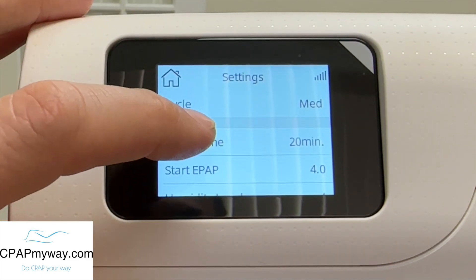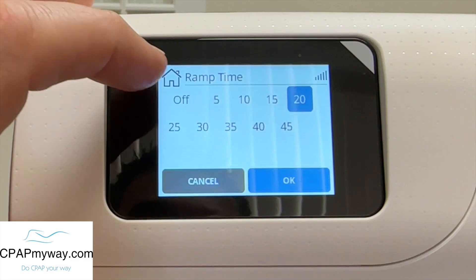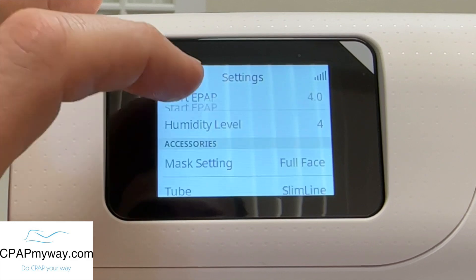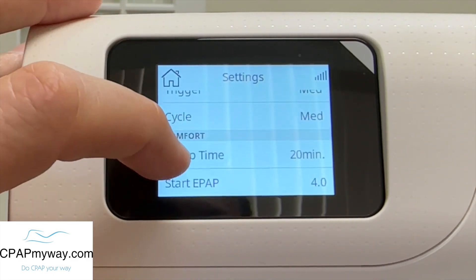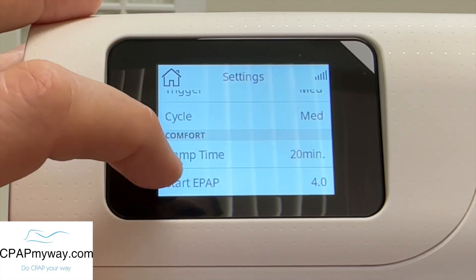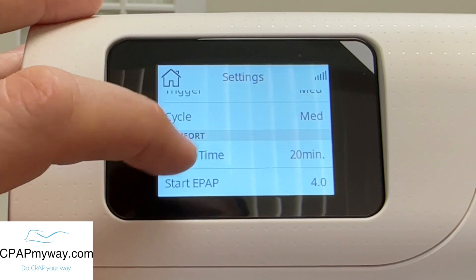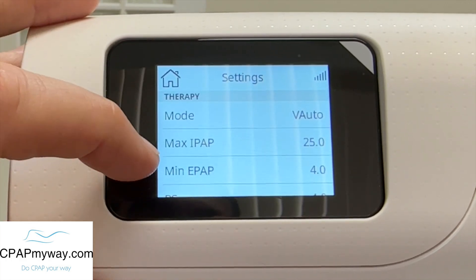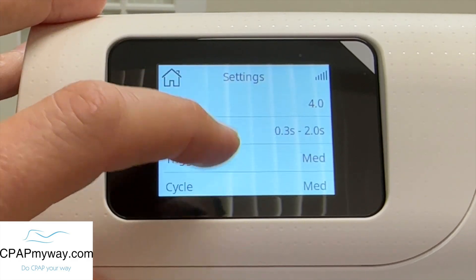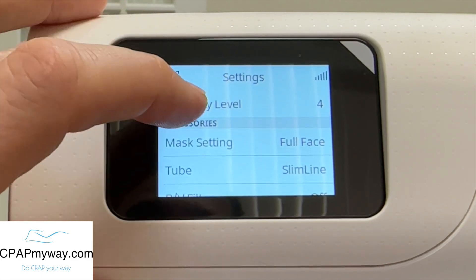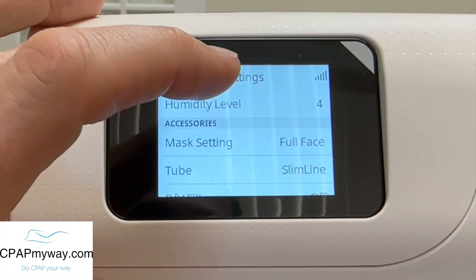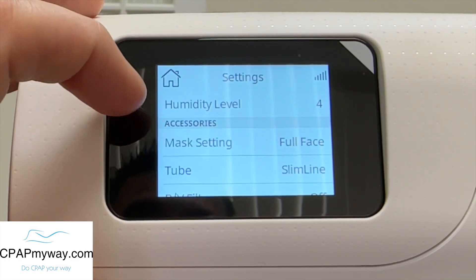Now you're down into the comfort settings. You've got ramp time, which you would set from off to 45. The customer typically can actually adjust that on their own as long as you give them permission. The starting EPAP is what pressure the EPAP will start at during the ramp cycle — typically in most cases, you want your EPAP starting pressure to be half of what your minimum EPAP is for comfort. But set it to whatever you think is right for the customer. Humidity level is adjustable from off to eight, and that can also be adjusted by the customer.